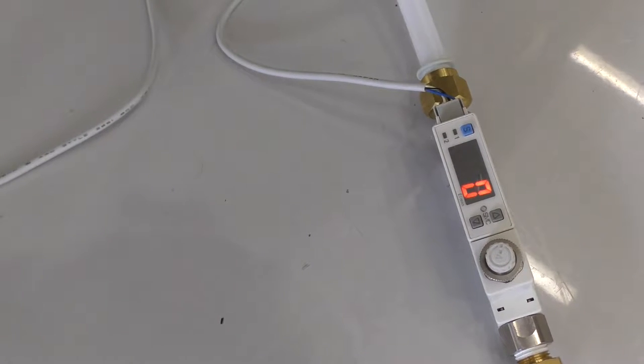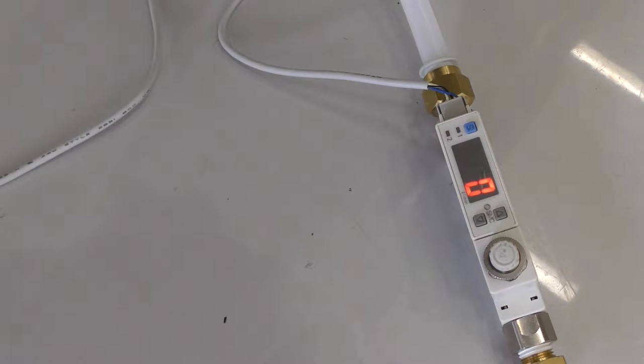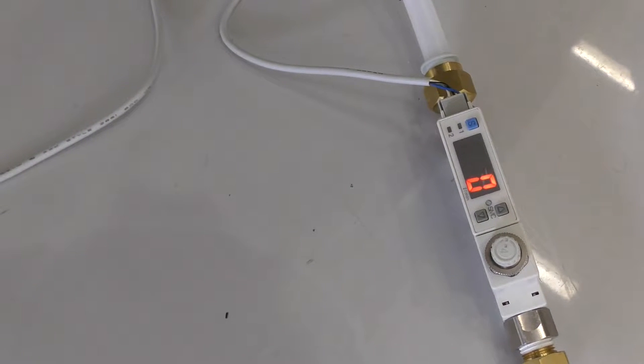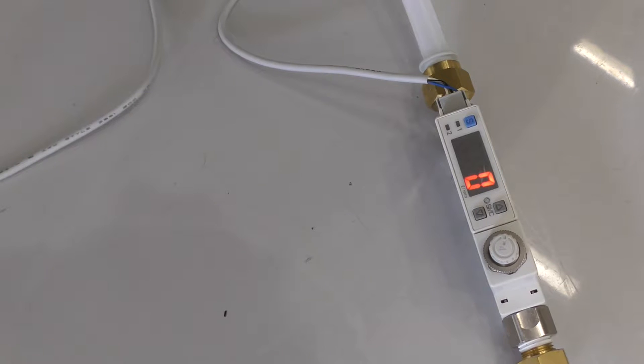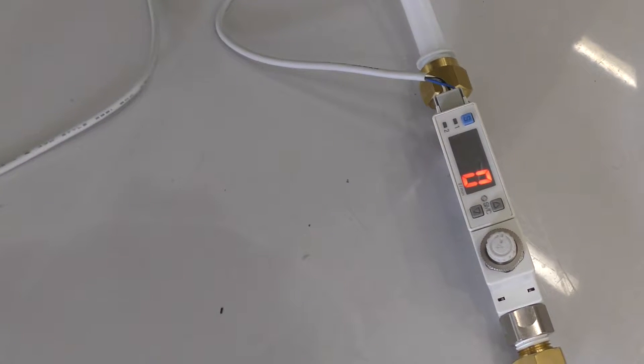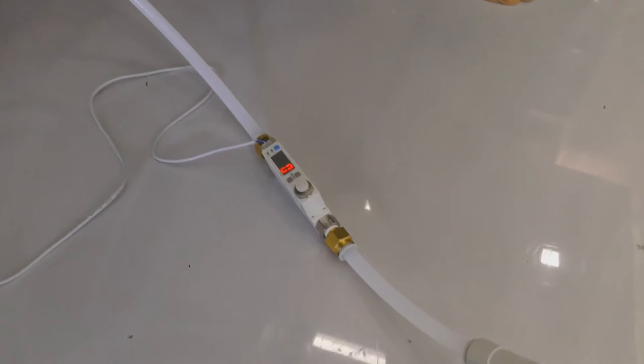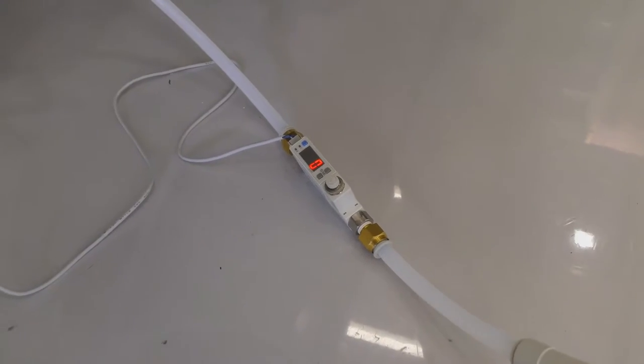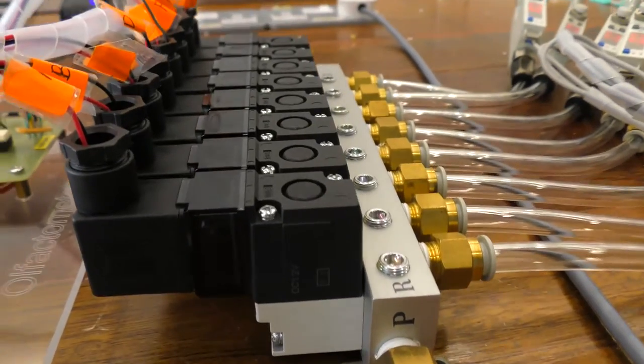The third one is the two-color digital display flow switch. This is to ensure that the flow rate of the air is measured accurately. At this system, we must make sure that the flow rate must be below 10 liters per minute.